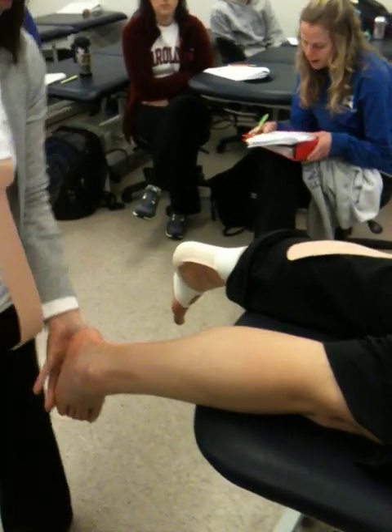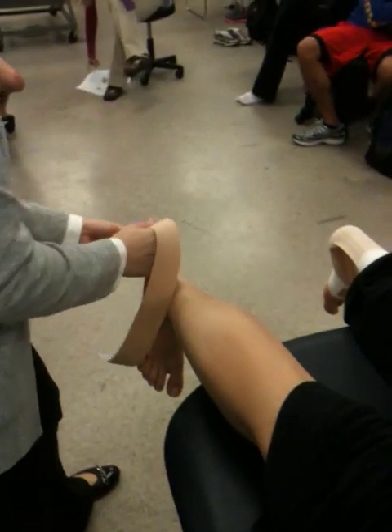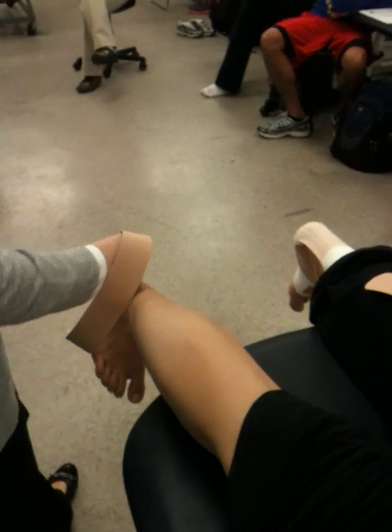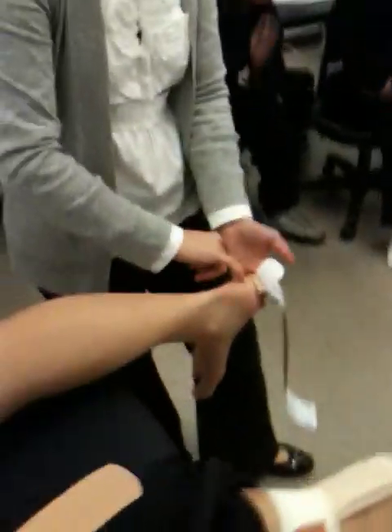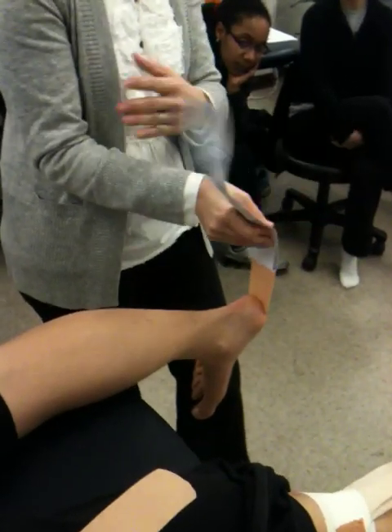I'm going to do my soleus first, so go ahead and pull up and under for me into dorsiflexion. Good. I lay down my base — if I know I have an Achilles issue, I'm going to make sure I'm on the bottom aspect of the calcaneus so I cover the whole attachment onto the posterior calcaneus. This is where we can start combining techniques.